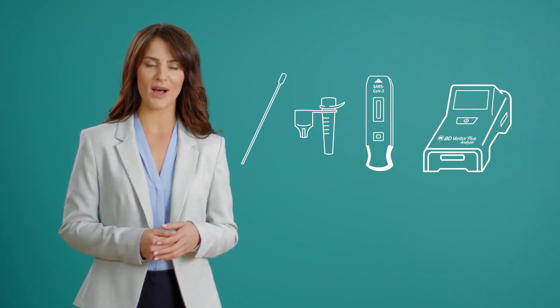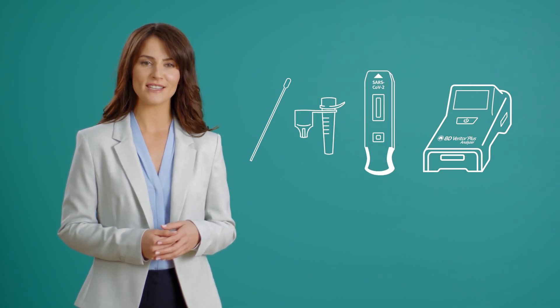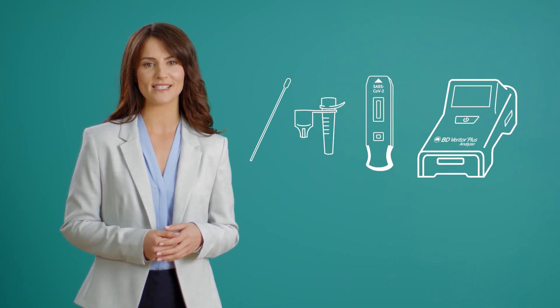A specimen collection swab, a SARS-CoV-2 reagent tube, a SARS-CoV-2 test device, and your BD Veritor Plus analyzer.